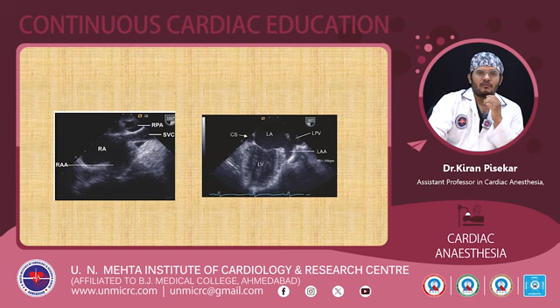Again, as I have mentioned earlier, this is the right atrium and the right atrial appendage, which is broad based and short, and here this is the LA with its appendage, which is finger-like and long. This is a major site for clot formation.